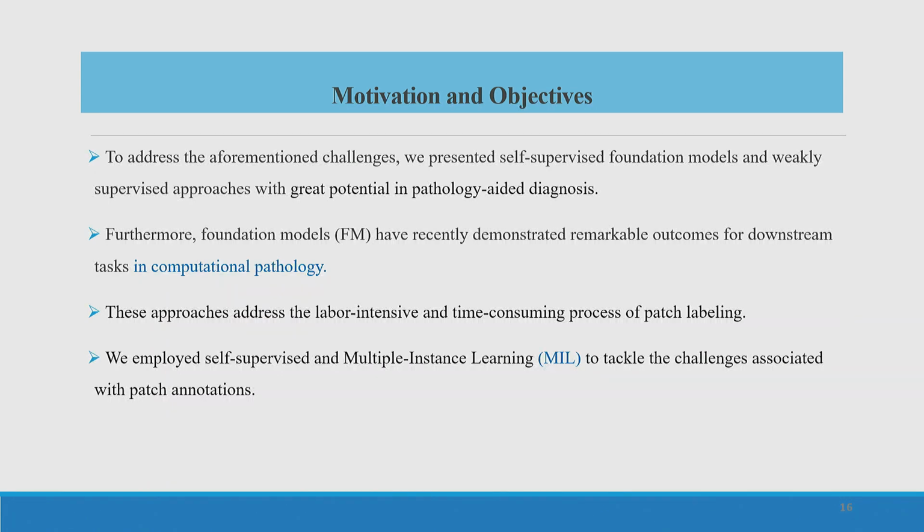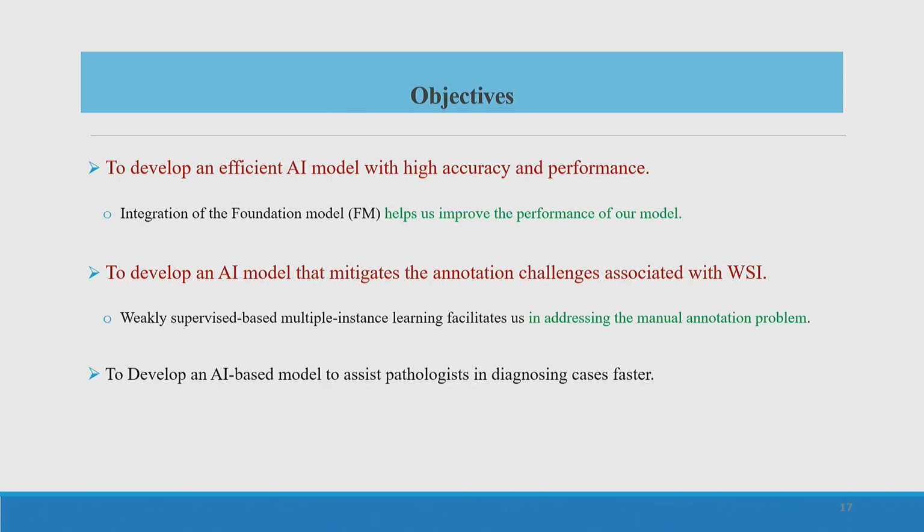Multiple instance learning is a weakly supervised approach which enables us to diagnose cancer without having tight labels of the whole slide images. So the objective is to develop an efficient AI model with high accuracy and performance, for which we have used a foundation model, and to mitigate the annotation challenges associated with WSI, we have used weakly supervised multiple instance learning.